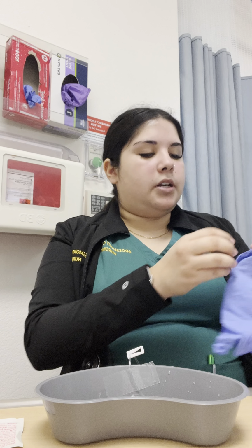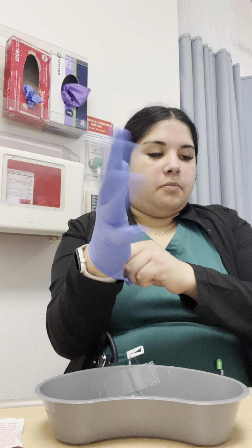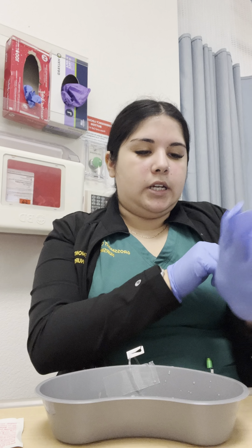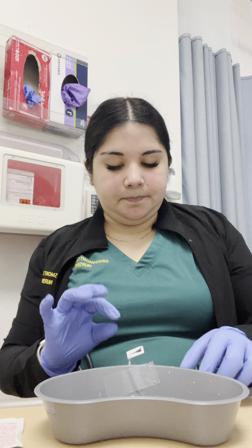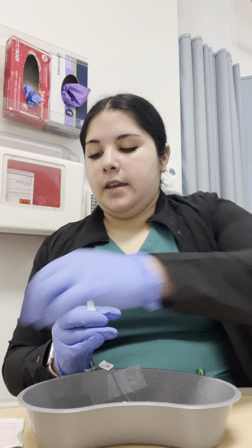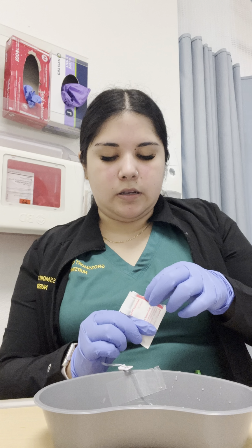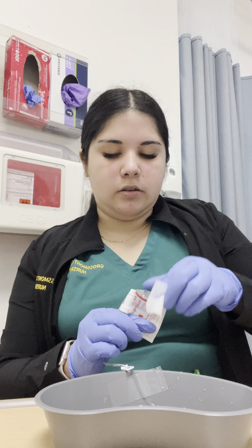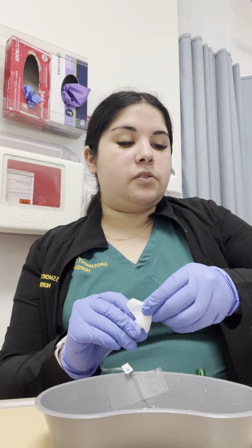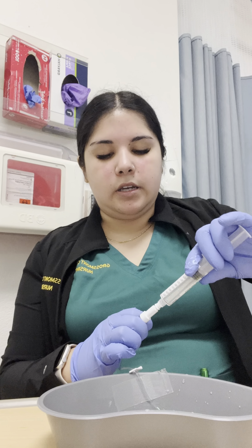Doing hand hygiene and putting on my gloves in preparation for flushing and administration. I have also brought with me a normal saline flush, 10 mLs. I will go ahead and unclamp the line and I will swab with alcohol for 15 seconds. Once having swabbed for 15 seconds, I will go ahead and take my normal saline flush and attach that.